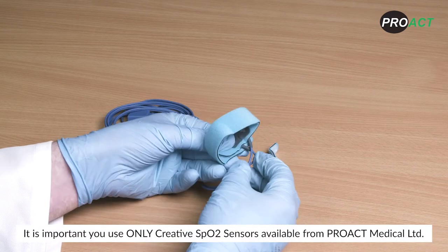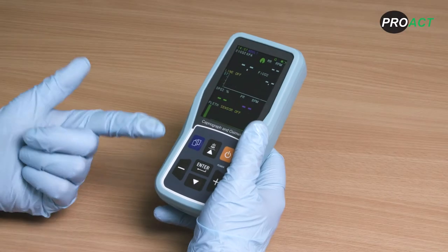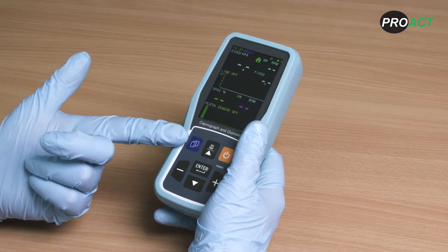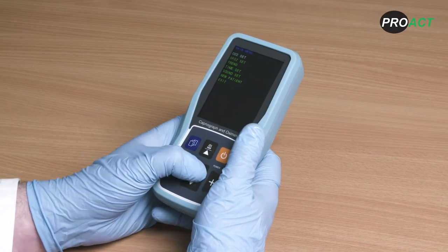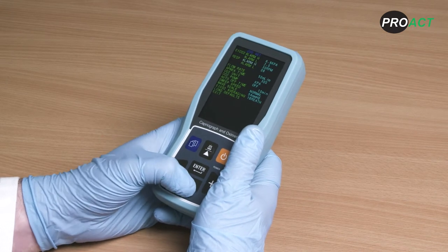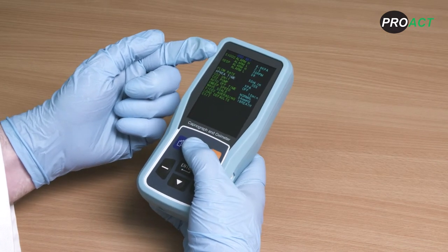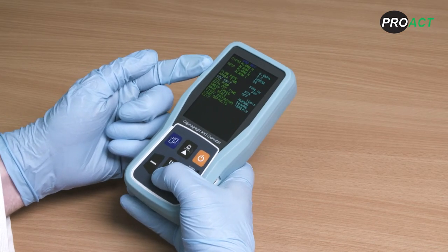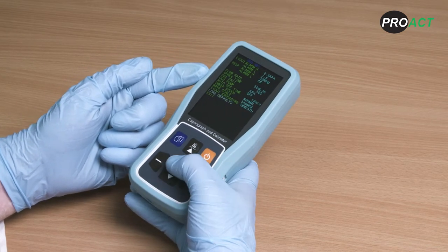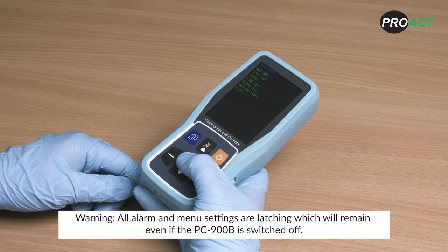It is important to use only Creative SpO2 sensors available from Proact Medical. The Creative PC900B has a whole range of user adjustable features accessible via the blue menu button. You can adjust the flow rate, apnoea time and alarm settings along with many other features. Should you wish to reset your device to default settings, press load defaults. All alarm and menu settings are latching and will remain even if the PC900B is switched off.